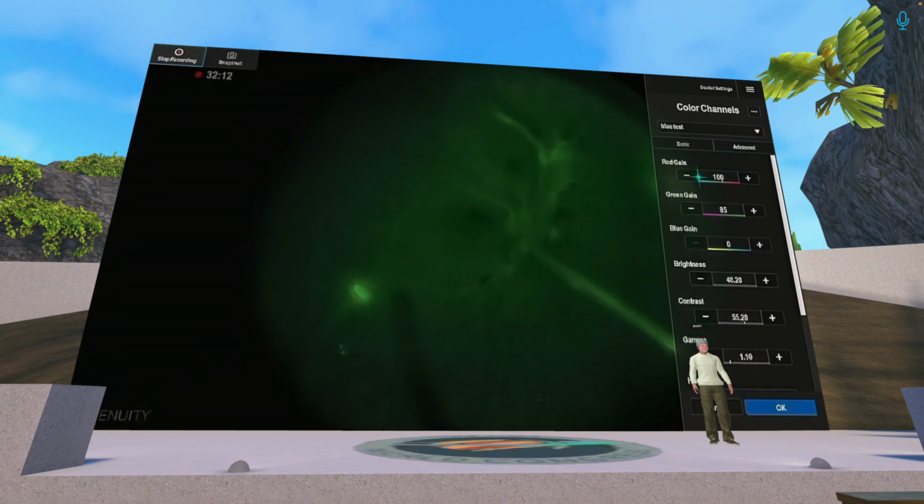And I don't mind a custom part of the software being released from Alcon for an intraop FFA pilot project, where the early adopters will have proper settings. Otherwise, they might be disappointed with the view that they get, and they will simply reject the imaging modality. This is my personal view on the topic.